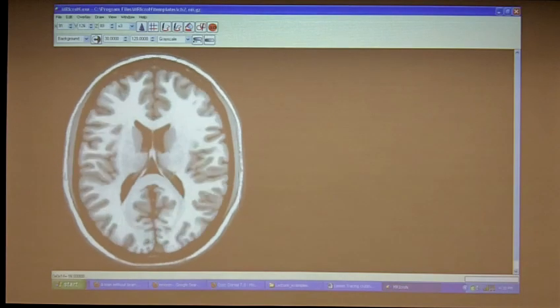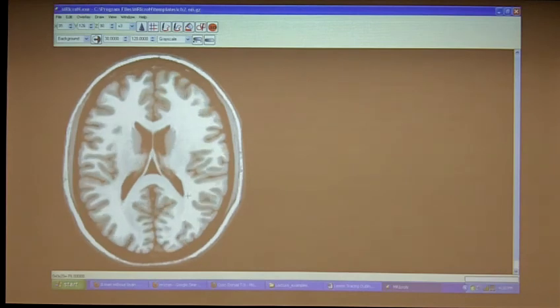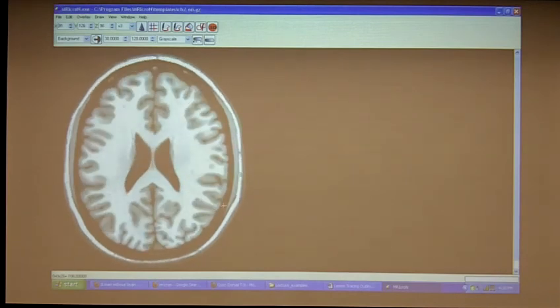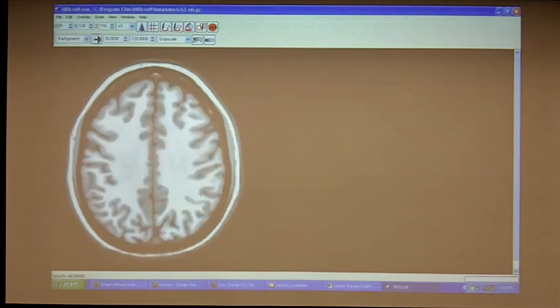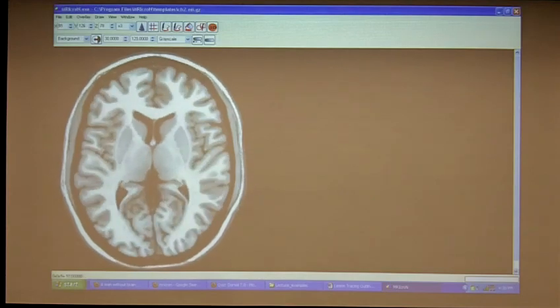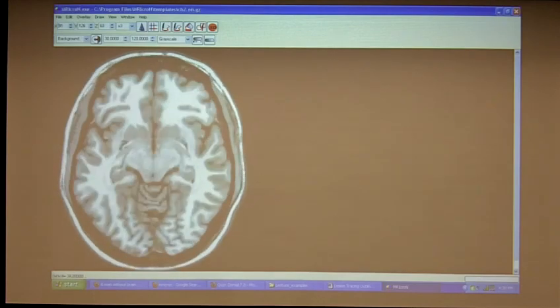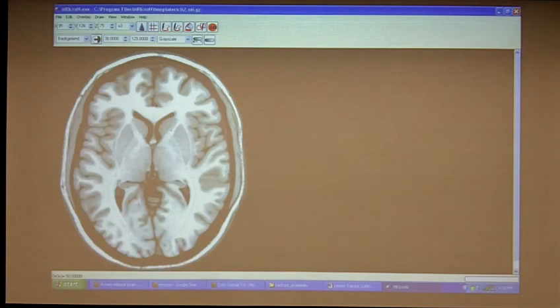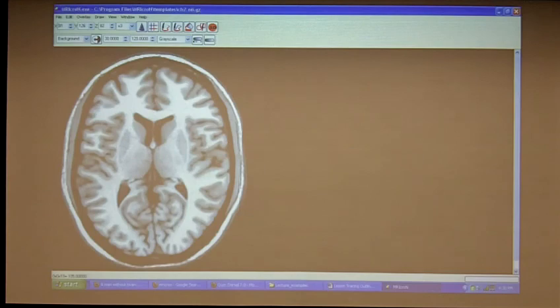And so one of the ways you can tell a sulcus from a lesion is that there's gray matter around it. You see these ribbons of gray matter. So that's a big clue that it's a sulcus. Sometimes it's hard to tell whether that gray matter is lesion or not. So it's not a surefire thing, but it can help. So this is the Sylvian Fissure, this thing that's jutting in here. And this is particularly for aphasia. It separates frontal from the temporal, and the insula are sort of tucked in there. And that's where we see a lot of aphasic symptoms if you have damage there, particularly on the left.